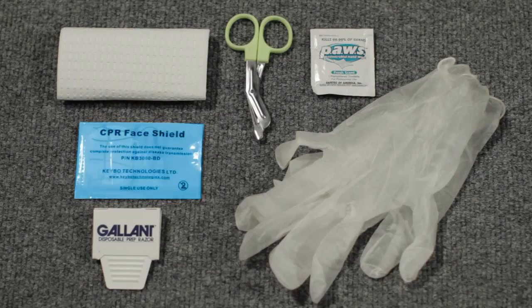A rescue accessory package is attached to the electrode pads, which contains a barrier mask for giving rescue breaths, a small pair of scissors for cutting clothing if necessary, a moist towelette for cleaning up, a razor for shaving any chest hair, a paper towel for drying the victim's skin, and a pair of non-latex gloves to protect your hands.